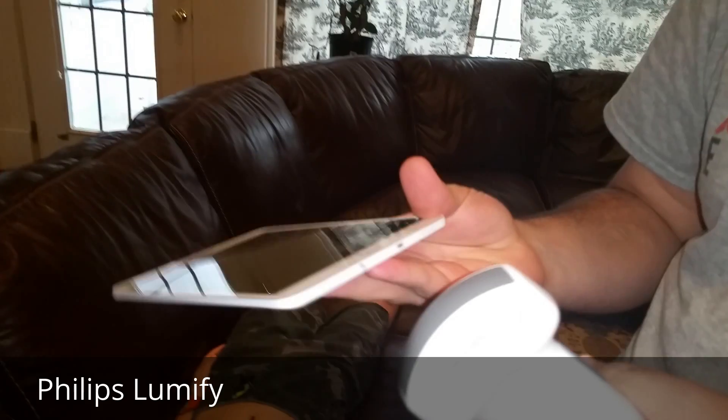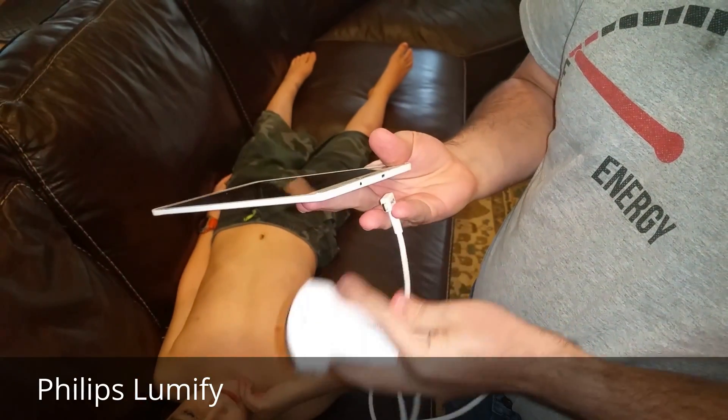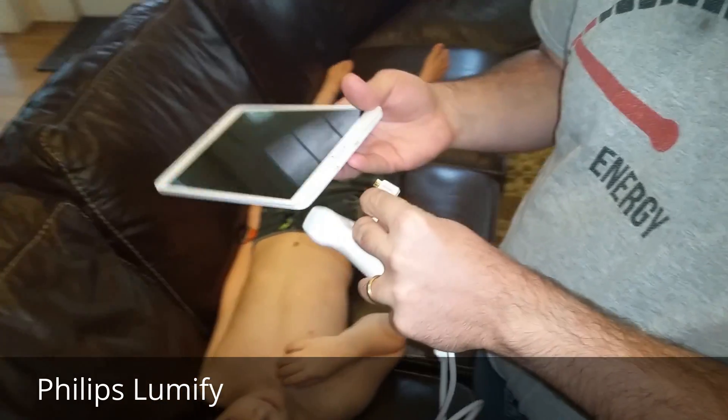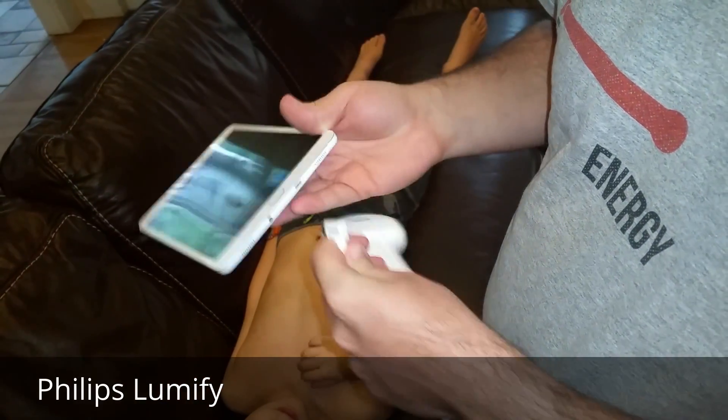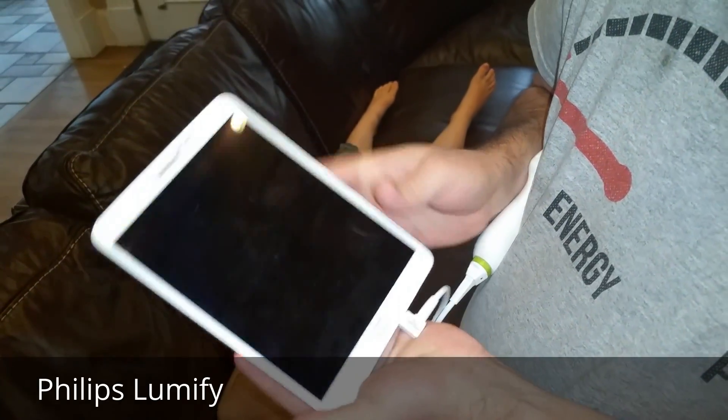This is a Samsung Galaxy, and the way it connects is through a standard micro USB port here. You lease this for approximately 200 bucks a month and then it basically plugs in like any old USB would.